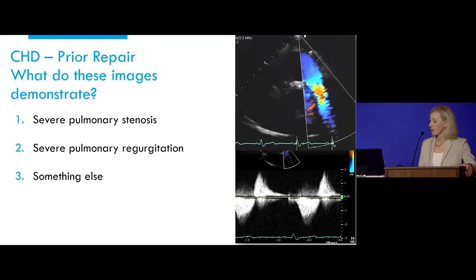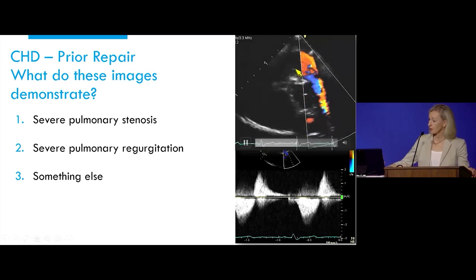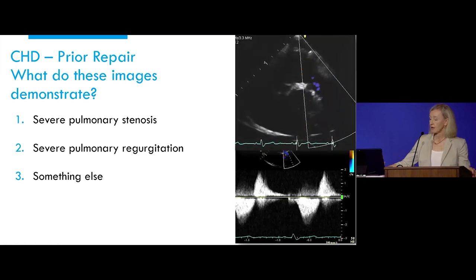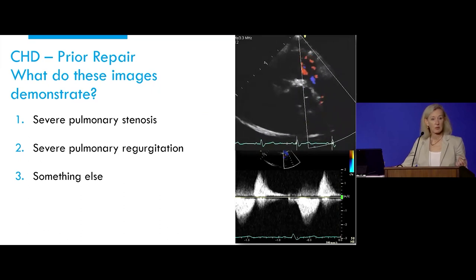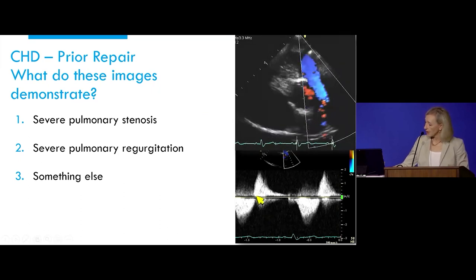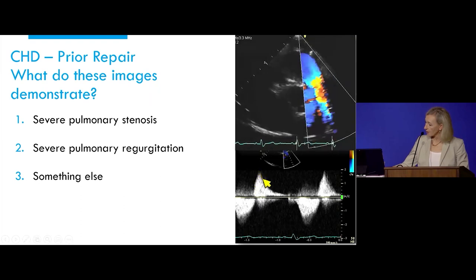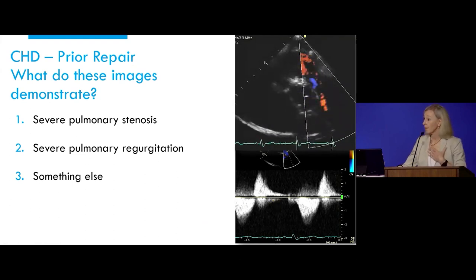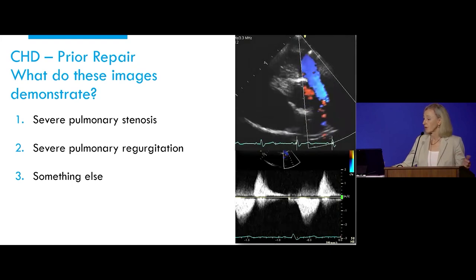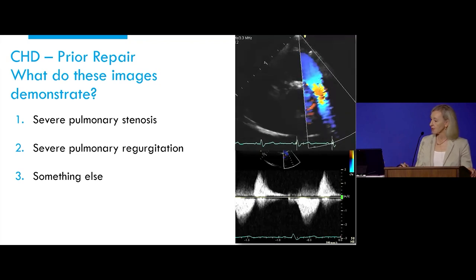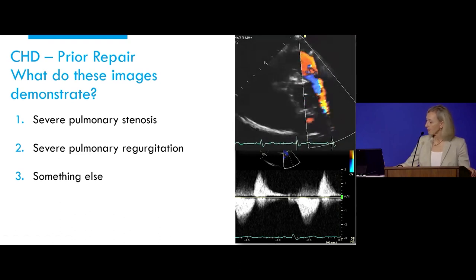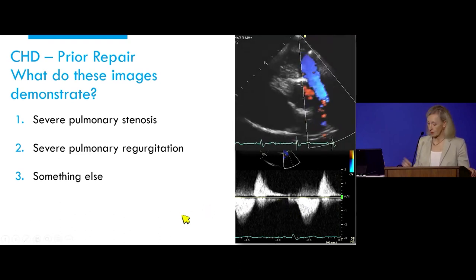Just a refresher. We see in this patient a really striking example of pulmonary valve regurgitation. You can see how brief it is in this continuous wave Doppler signal — rapid upstroke and rapid deceleration to baseline. So it's often missed. Even in our own adult lab this can be missed, because one doesn't recognize this absolutely classic continuous wave Doppler signal.